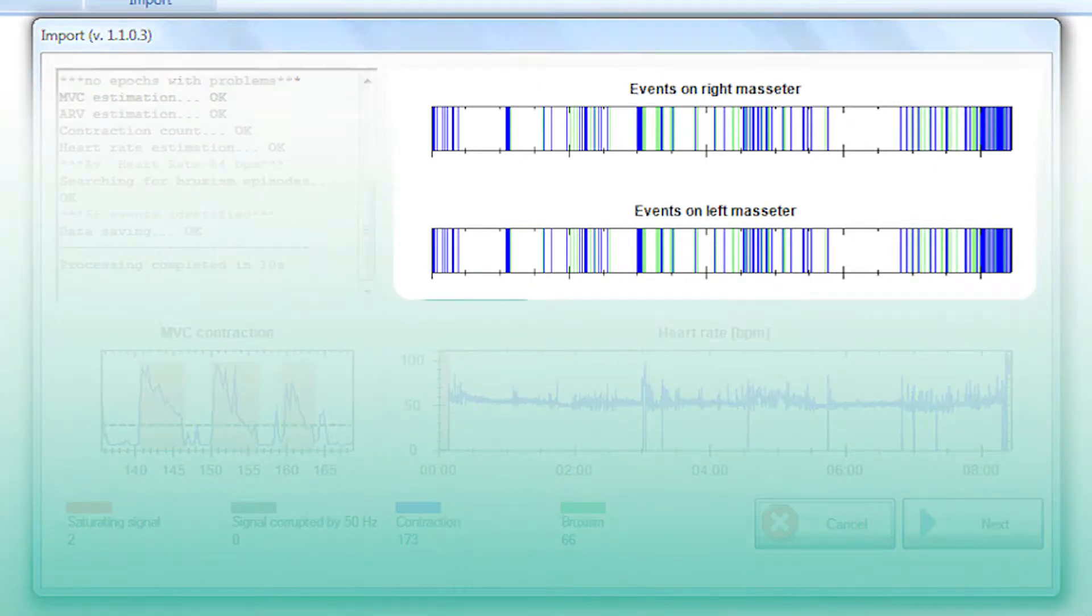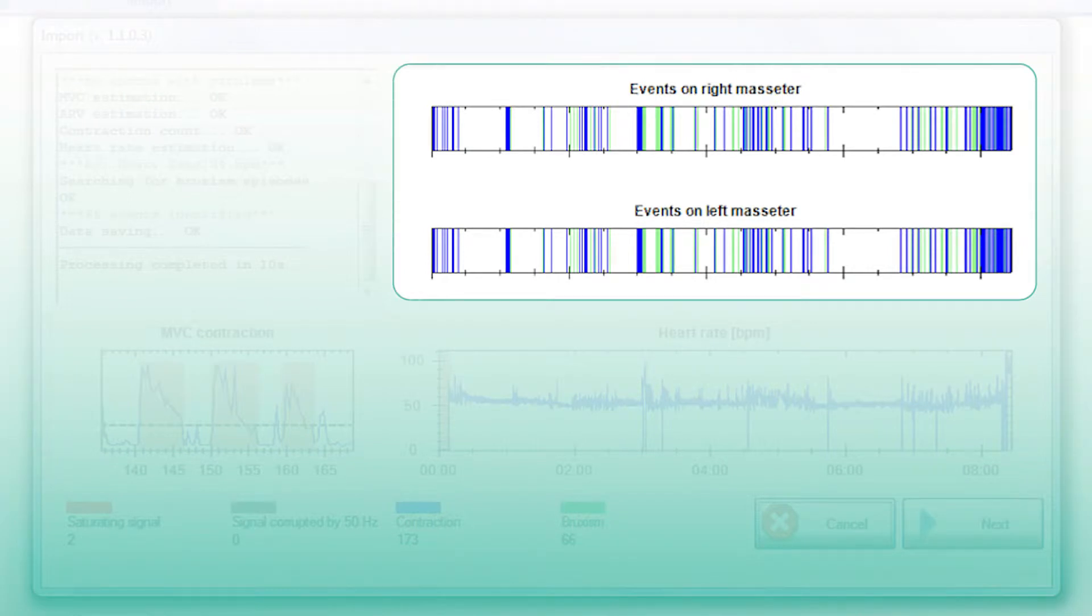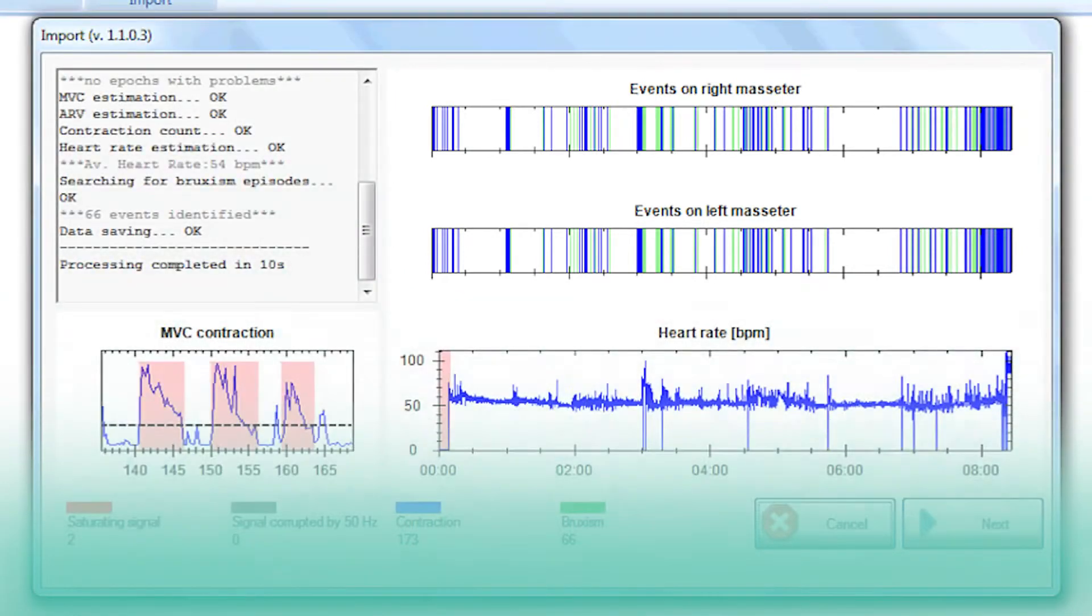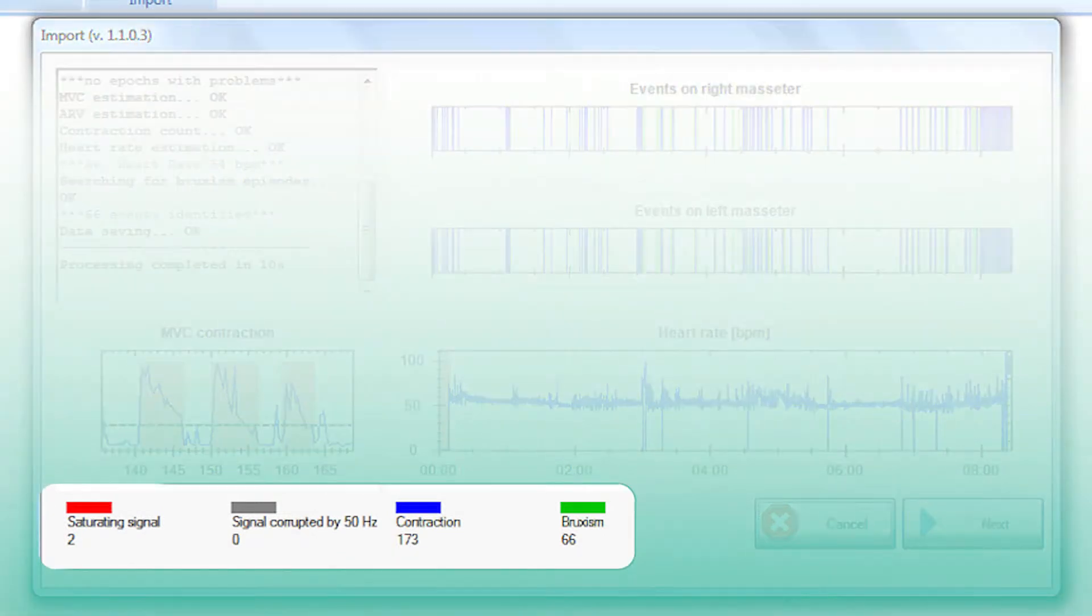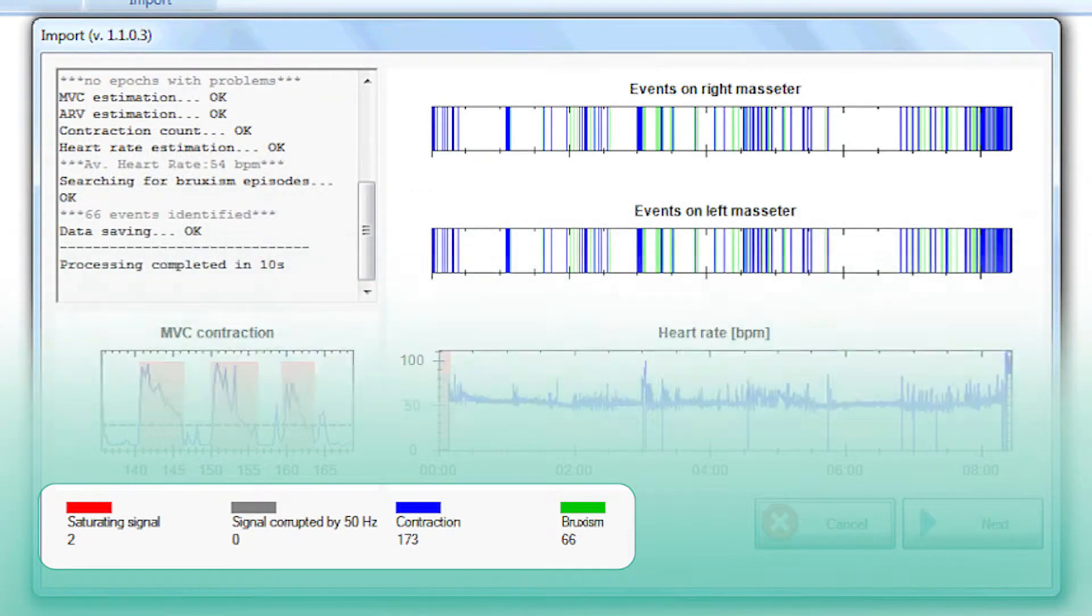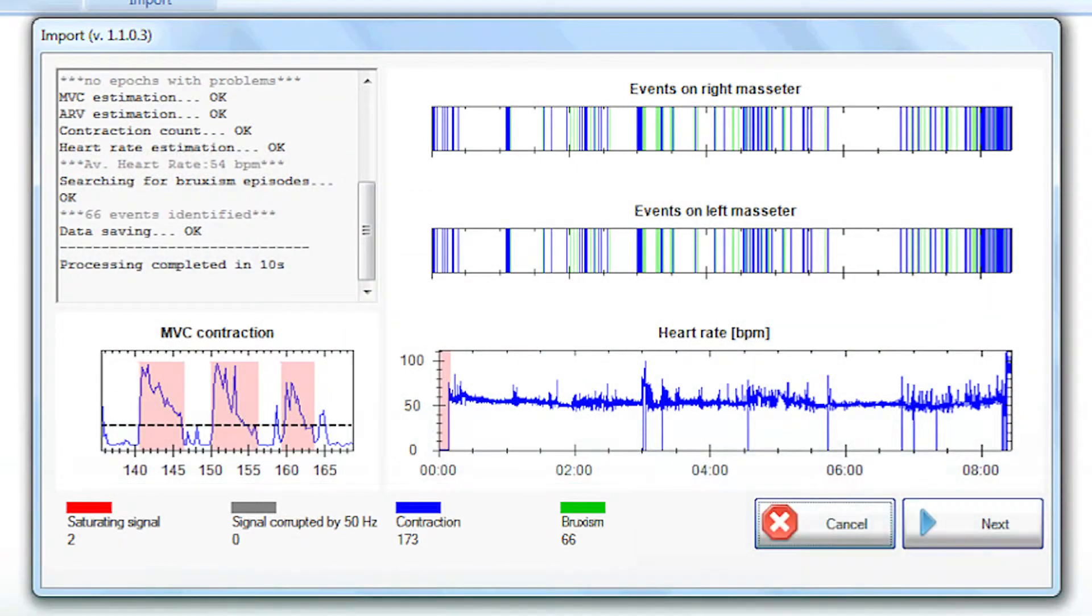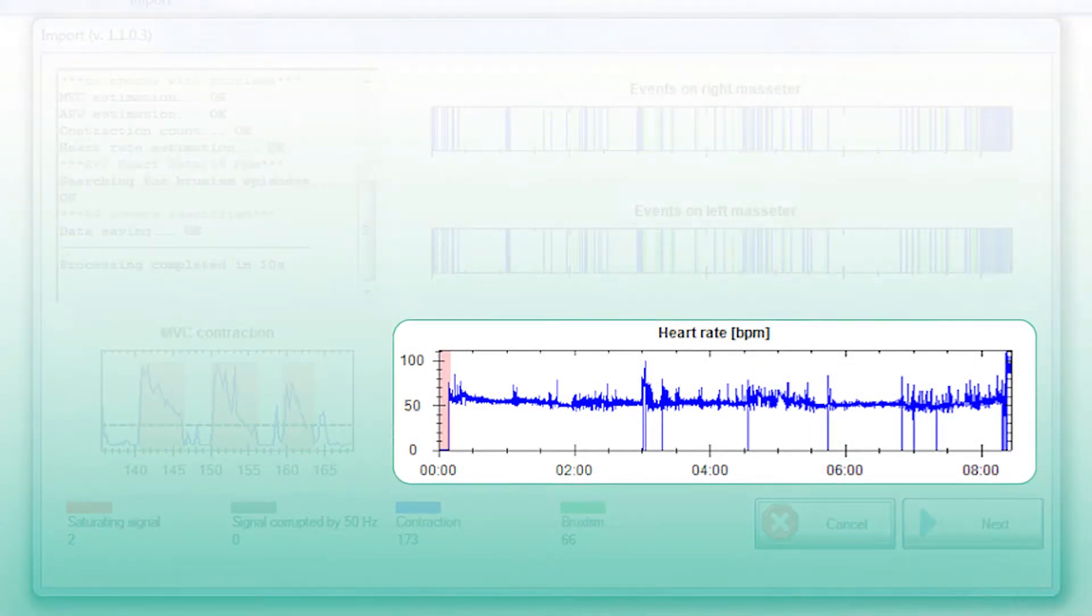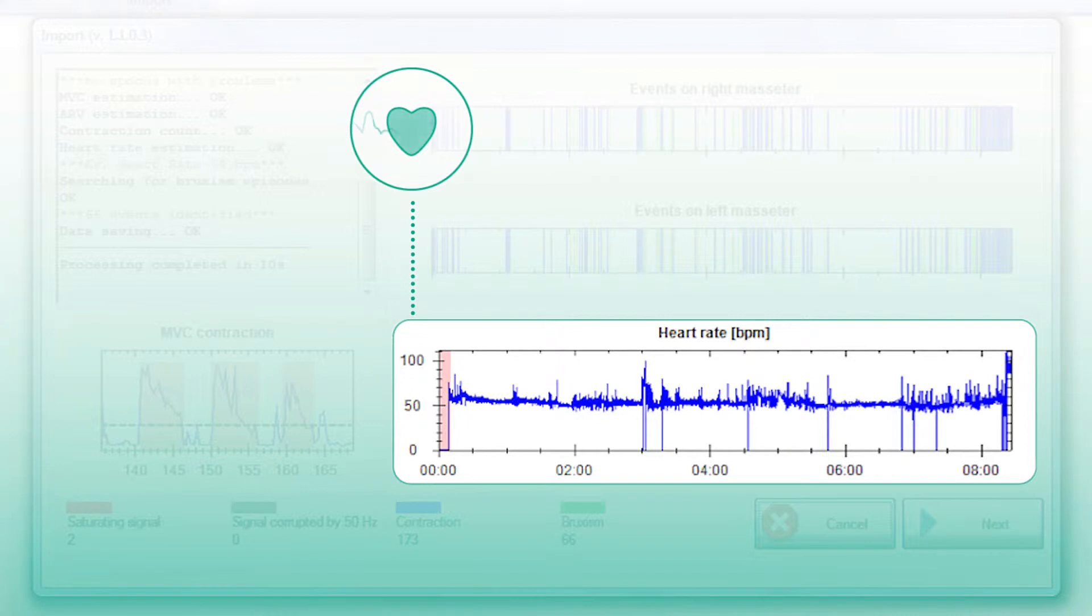Two graphs with colored bars are produced, showing identified events throughout the night. The key on the bottom left shows the number of events identified and specifies their type. The bottom right graph shows the heart rate throughout the night.